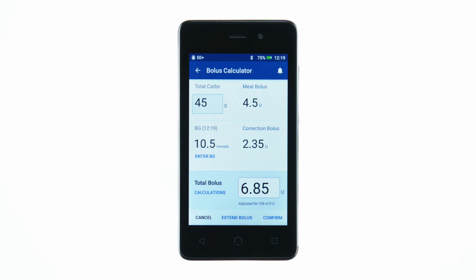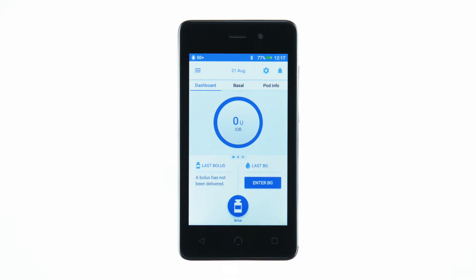The Omnipod Dash System's bolus calculator calculates a suggested bolus based on entered blood glucose levels and the amount of carbs in the meal. The bolus button is accessible from the home screen. To begin, tap the bolus button.